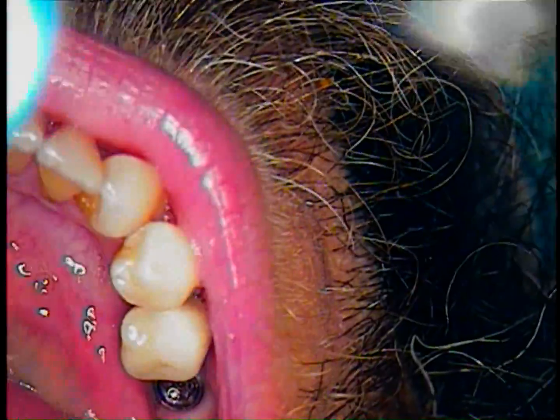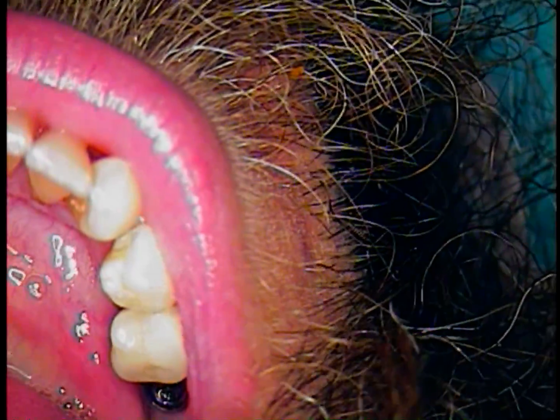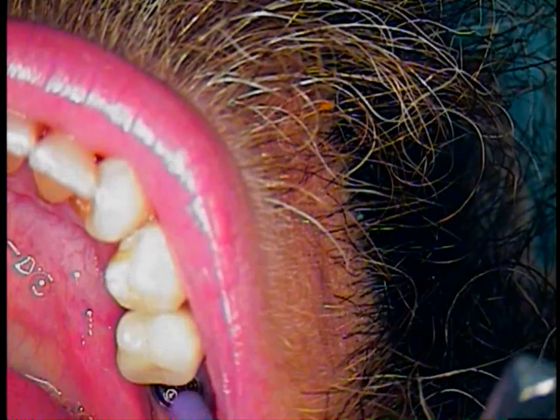We've already made an attempt to slot the broken screw head on this broken implant retrieval case. So we've done a little bit of both. We've actually did a little bit of slotting, extended the slot, the overall length of the slot, and we've also honed a number of instruments.